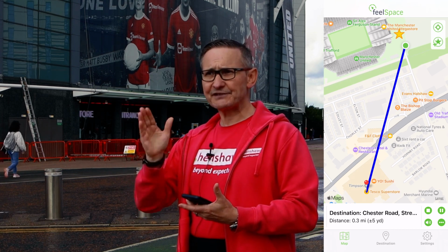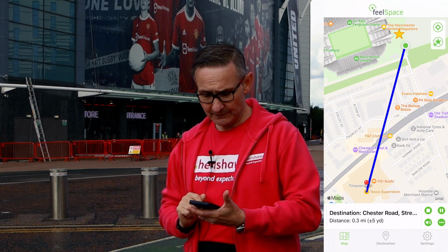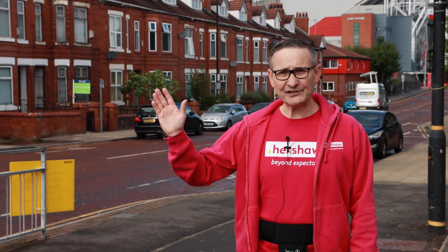So that's why I'm going to add to as much as I can, which is going to be down this straight road. But then I'm going to start moving to the right, okay? So there you go, let's go. So the naviBelt's telling me to do a kind of a sharp right, which I'm going to do. So I'm going to cross this road now and just keep doing what it's telling me to do. So Tesco, here I come.